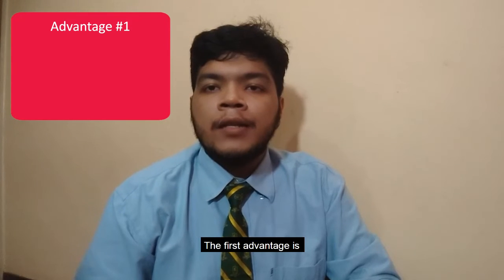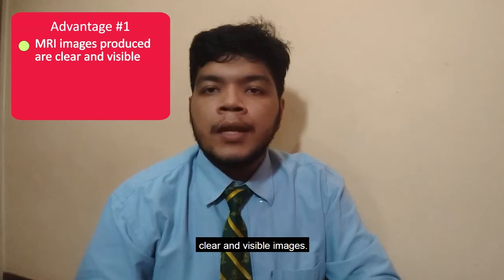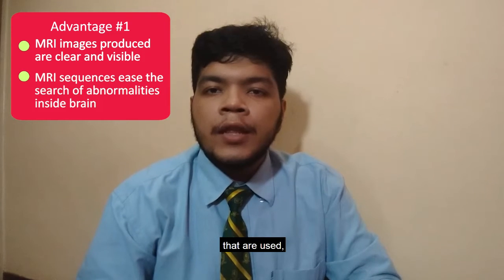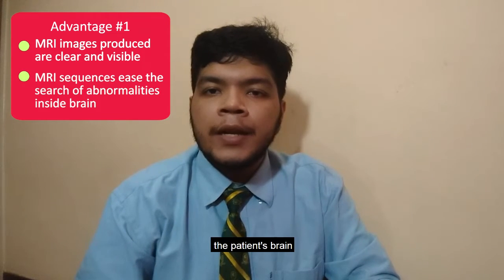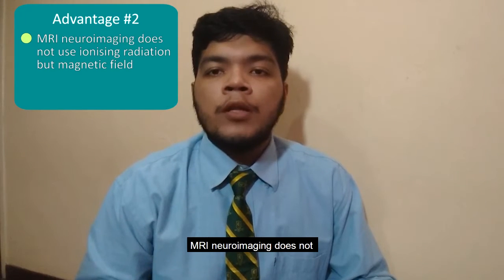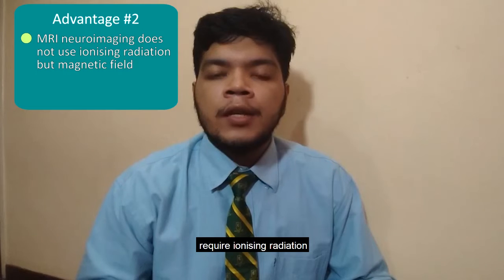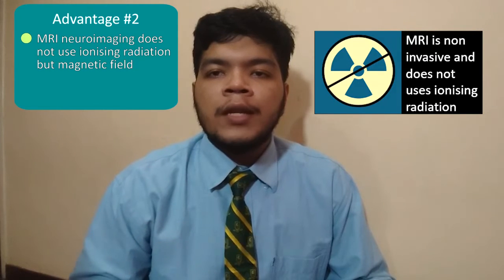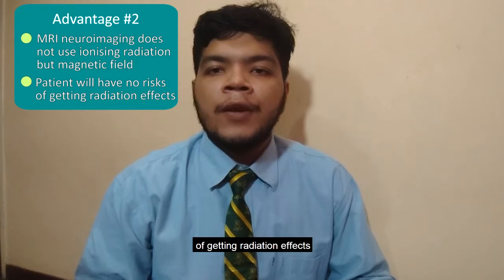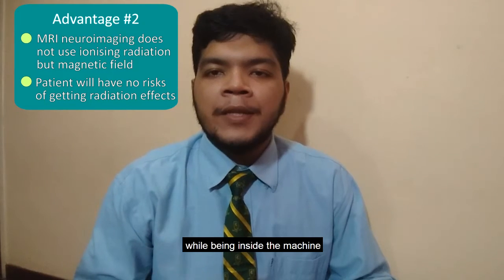The first advantage is MRI imaging produces clear and visible images. Thanks to the different sequences that are used, the abnormalities inside the patient's brain can be detected precisely. The second advantage is MRI imaging does not require ionizing radiation. It only uses a magnetic field when taking images. Therefore, the patient will have zero risk of getting radiation effects while being inside the machine.